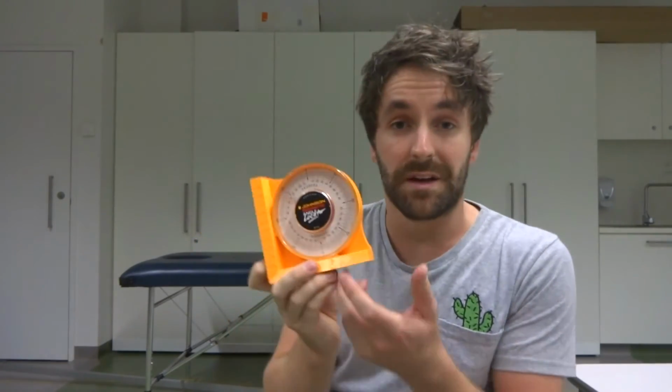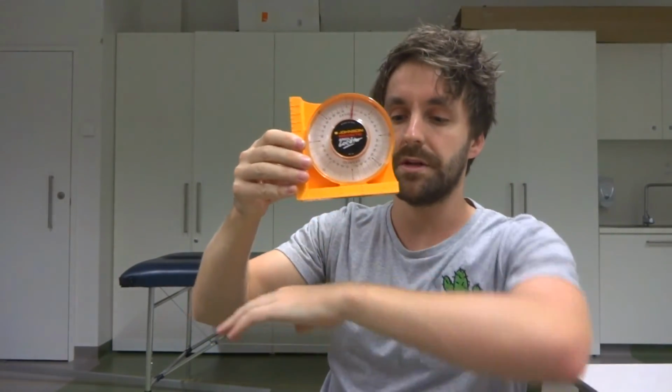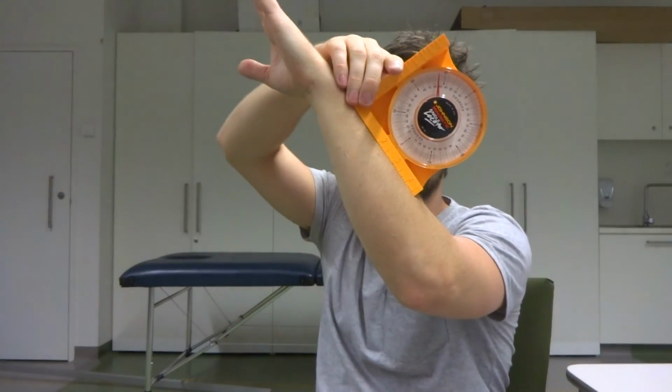Another piece of equipment that we might use to measure range of motion is this guy here, which is called an inclinometer. Now this is a magnetic inclinometer. We can also have a digital inclinometer. They essentially do the exact same thing. So we can see we have a reference value at the top, and if we orientate it like this, that's starting at 0. And then we can place this on top of a joint, on top of a movable arm of a joint, and then go through range of motion, and you can see how we can then take a reading from there. We'll show you a couple of examples of when you would use this versus when you would use this.